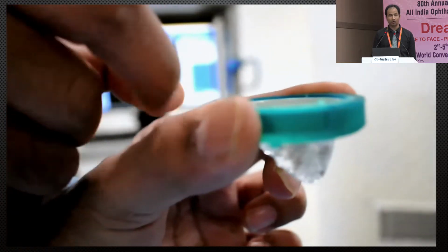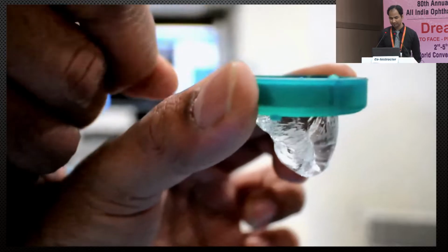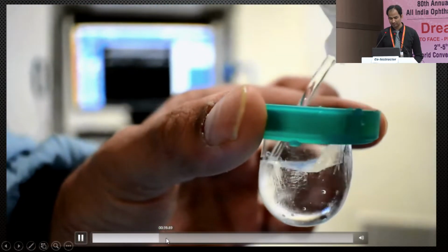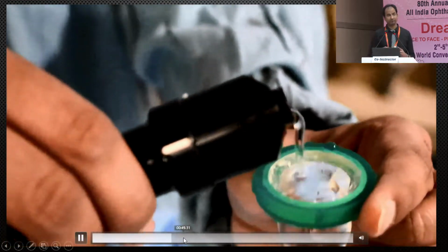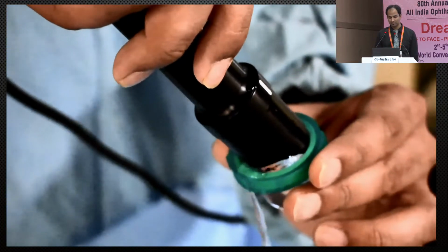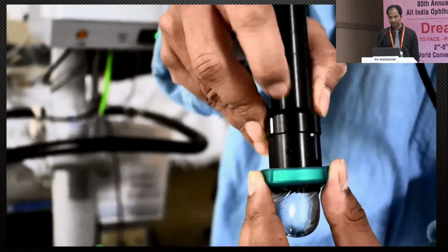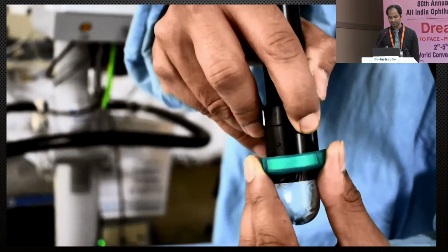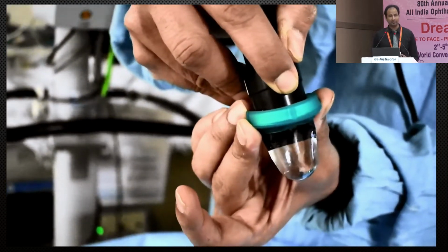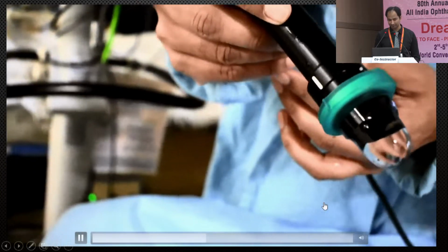Care should be taken not to touch the film, because if we touch it, it might rupture. So it is completely filled like this. Then we fix the probe. There is no need to apply the cover in between. So we fix the probe completely like this. Here is a button. This button is pressed to insert it. It should be inserted completely tightly to appear like a bullet, so that there is no air in between.